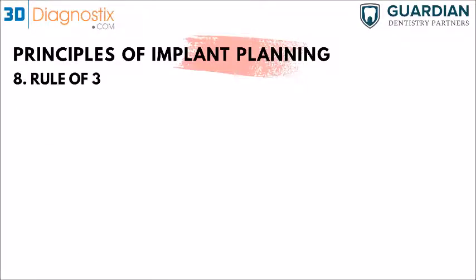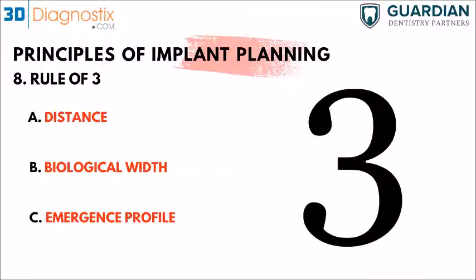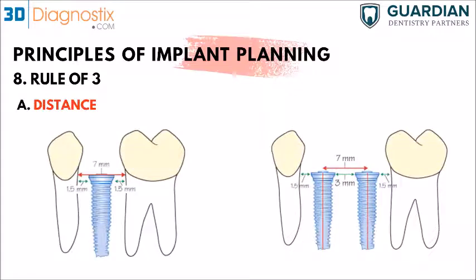So this is the rule of 3. Basically the number 3, or 3 millimeters, we can see in planning, and all 3 on the left side: distance, biologic width, and emergence profile. This is also stuff that we take into consideration when we plan, starting with the distance. If it's only going to be a single implant on the left side here, you need to maintain at least 1.5 millimeters on each side, distally and mesially. That, of course, would be a total of 3 millimeters.